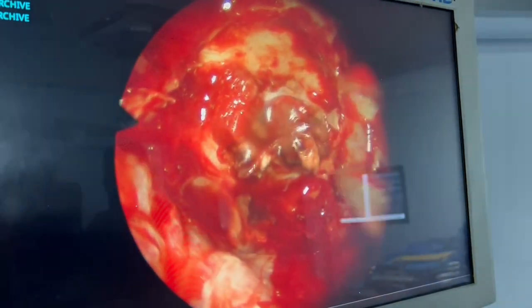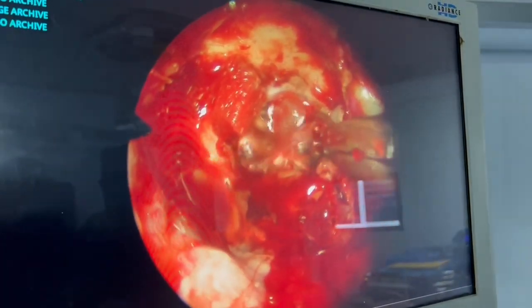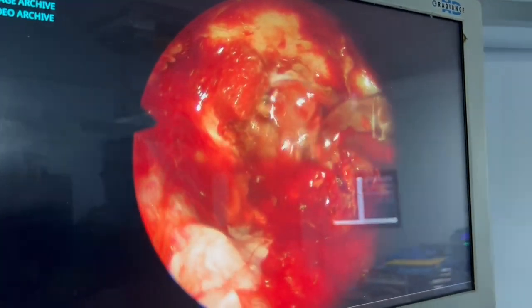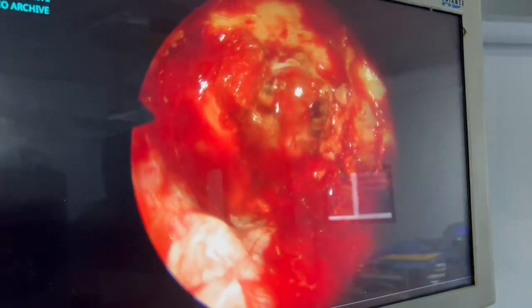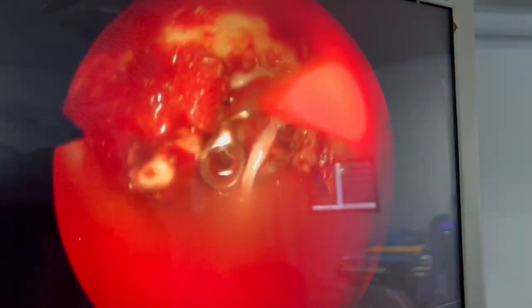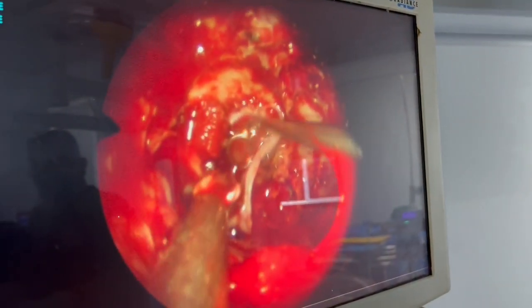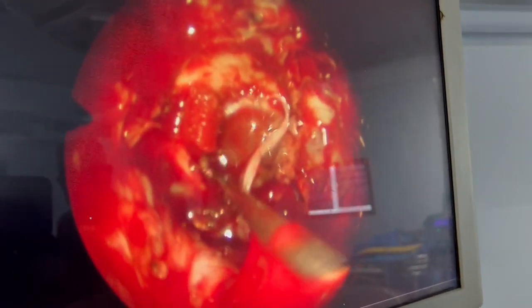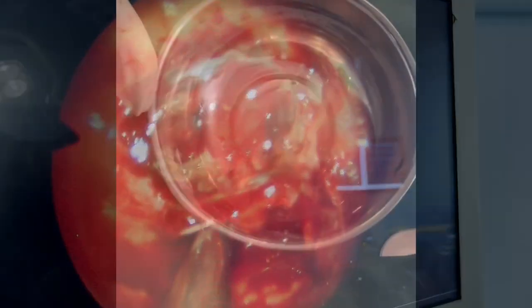After removing this last bit of the right cavernous portion, we will check with the 30-degree endoscope whether any tumor is inside the cavernous sinus. The arachnoid falling by itself is suggestive of complete tumor removal. You can see pulsation, and this is the right cavernous part of the tumor going inside the cavernous sinus. We will remove it. We have kept Floseal to prevent bleeding on the right cavernous part.